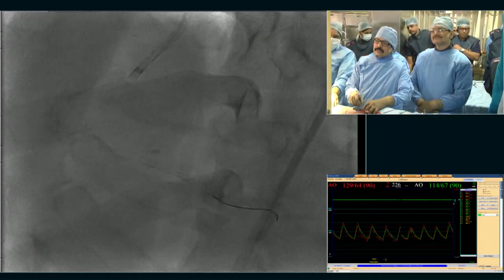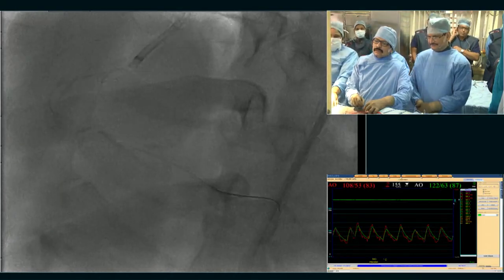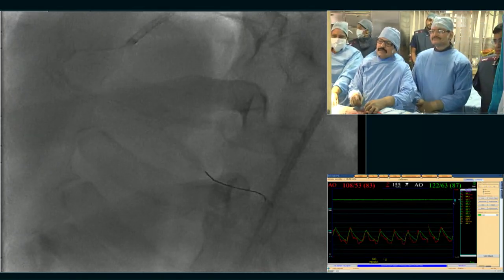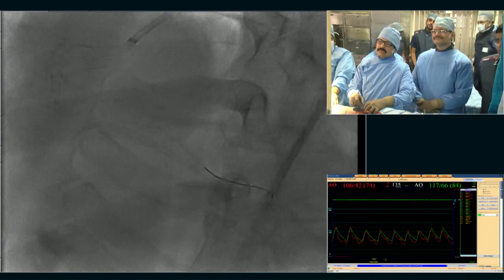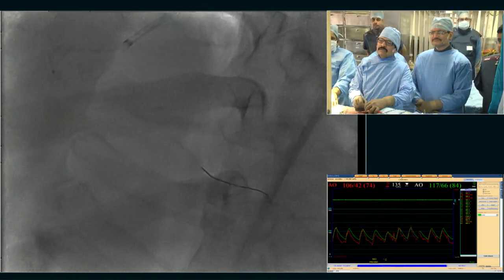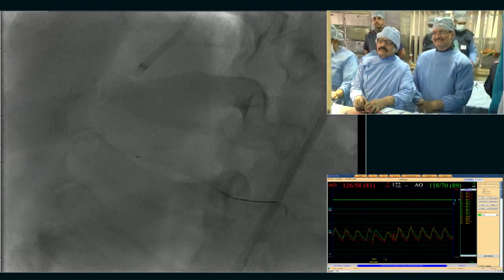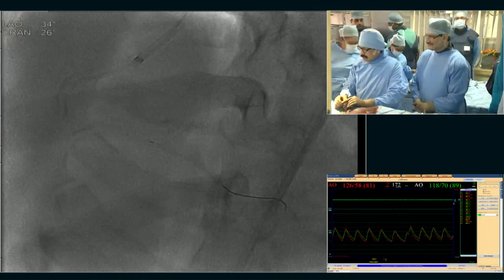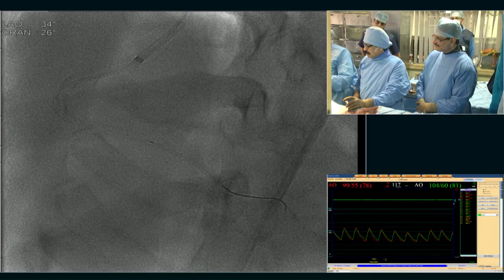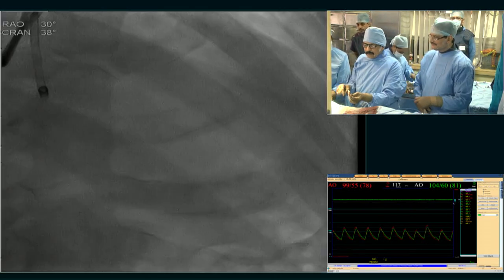So what would be your choice for the wire to cross? Sion, I would say. Pilot, maybe, for the PLV we will look for the wire. Why a stiff wire for crossing a side branch? Nobody needs a stiff wire. I don't need a stiff wire for that. Intermediate wire. Okay, take the wire. Do you think he will succeed to cross? Hopefully we will do that. Who thinks he will succeed? A few, huh? So you are not optimistic, yeah?